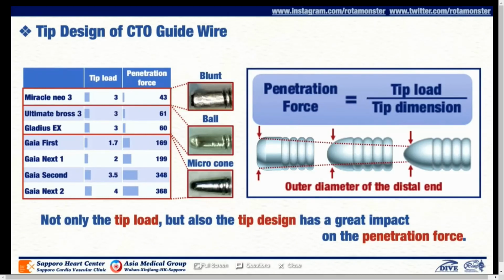First, I will explain the relationship between penetration force and the tip design. Even after more than 30 years of PCI, many operators still think that penetration force and tip load are the same.